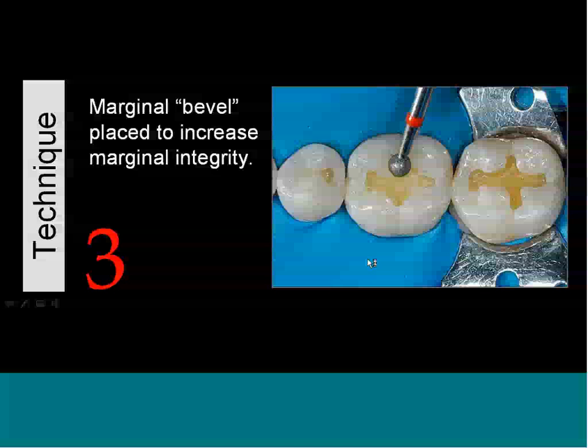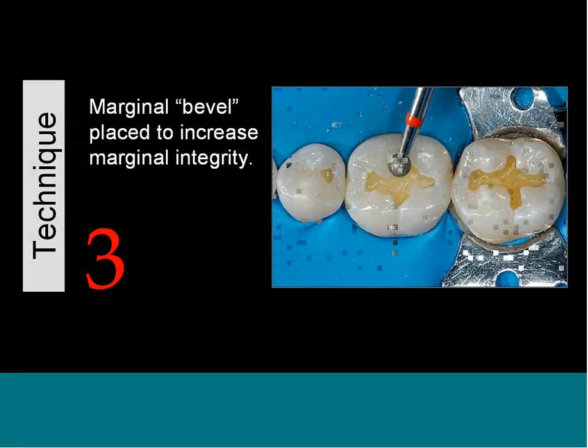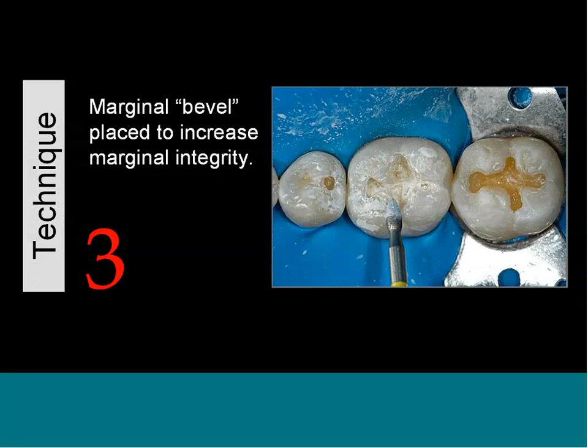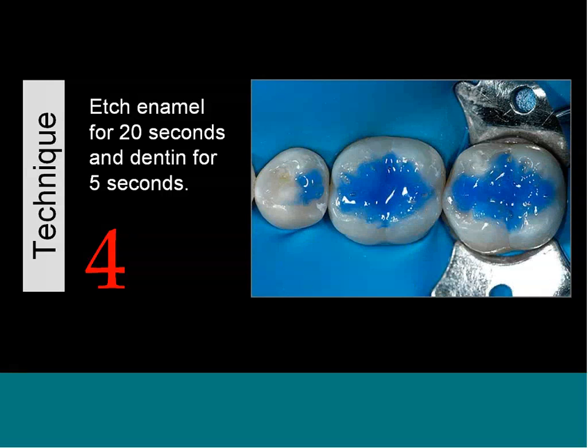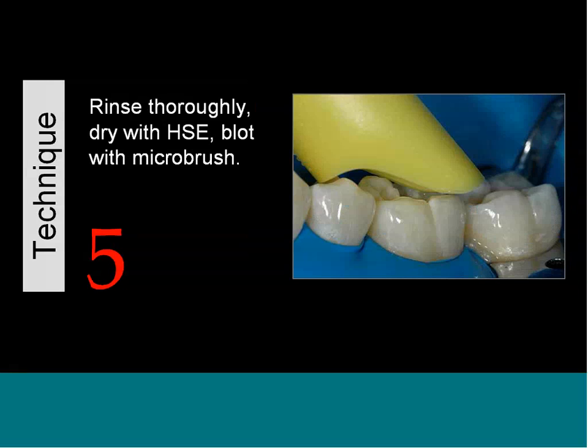And then I talked before about the bevel. The bevel is really just cleaning up the enamel rods, the edges, so we get the maximum etch we can get there. You can use a round bur to do that, or a football bur. And after we rinse and clean that up, here we're going to talk about total etch. Later we'll talk a little bit about self-etch. So you want to etch the enamel for 20 seconds, which you're doing here, and then the dentin for 5. And you're going to rinse that off.